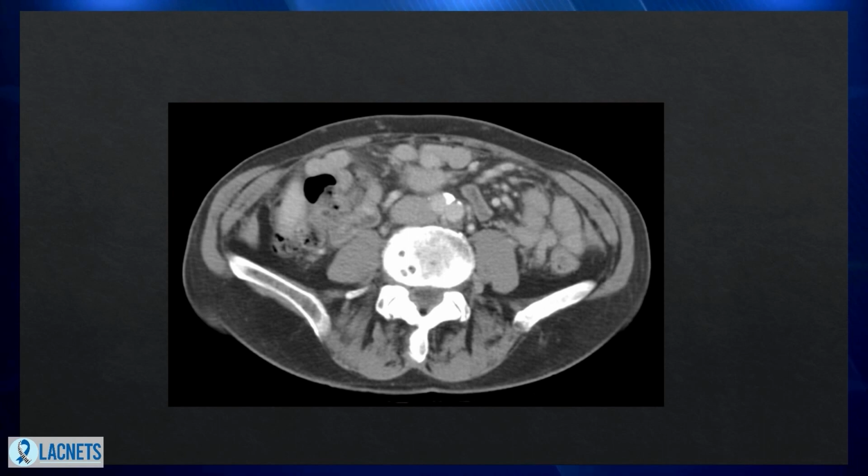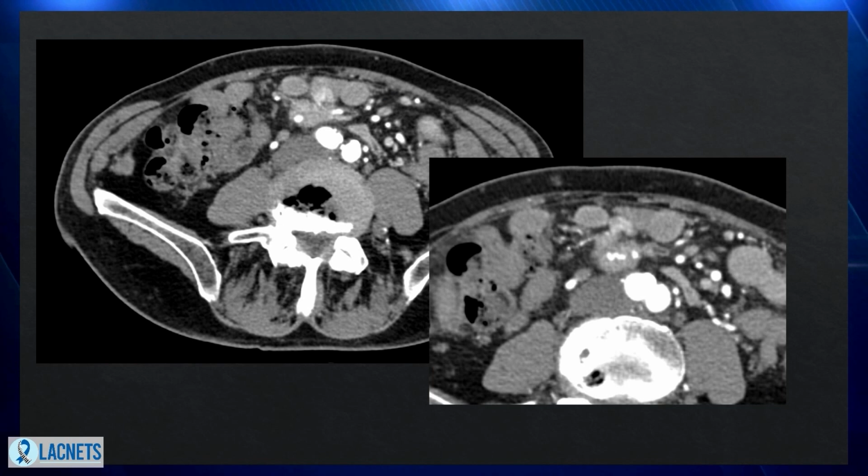Even for a trained radiologist looking at this CT, for example, there is a lesion in the mesentery that looks exactly like the bowel and is difficult to see. Now, on the arterial phase, we see it better. We see that there is this lesion in the mesentery, and the primary is in the small bowel. It's a very tiny primary, and it enhances on the arterial phase.